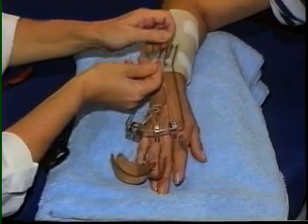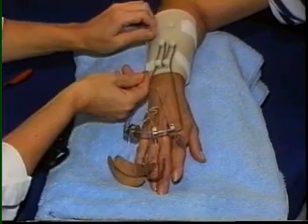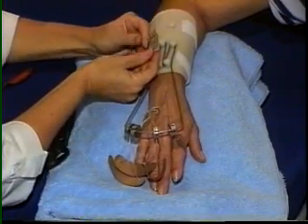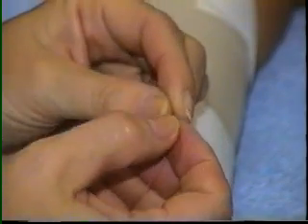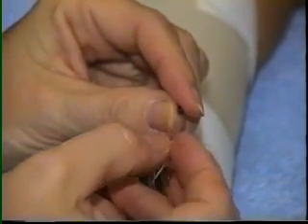Length is adjusted so that the patient can achieve full extension of the fingers as the wrist is at neutral. A line connector or fisherman's knot can be used to fasten the nylon line.